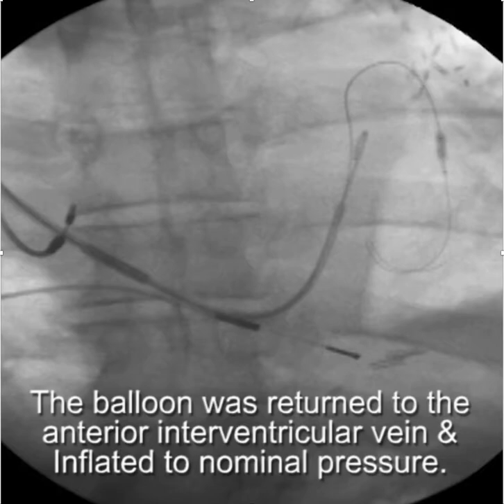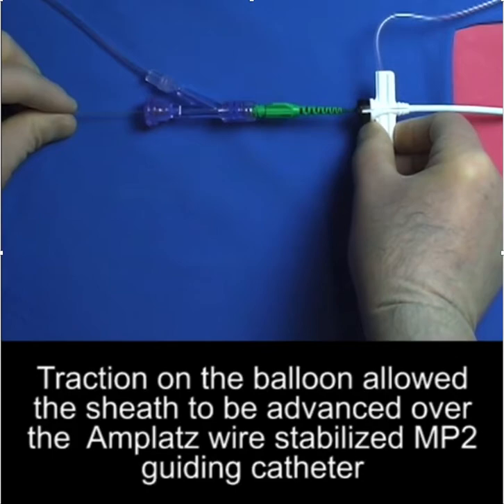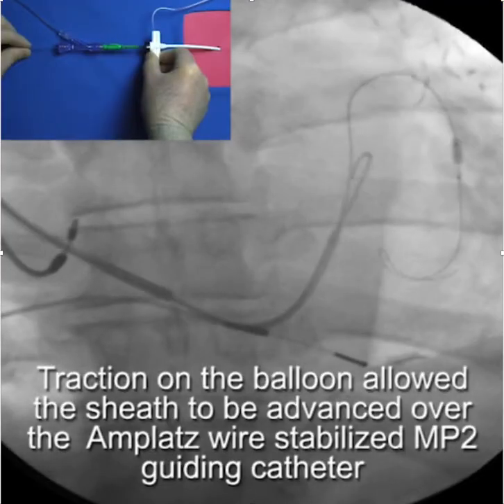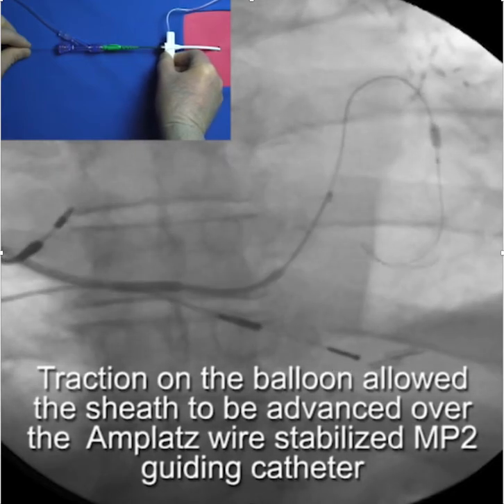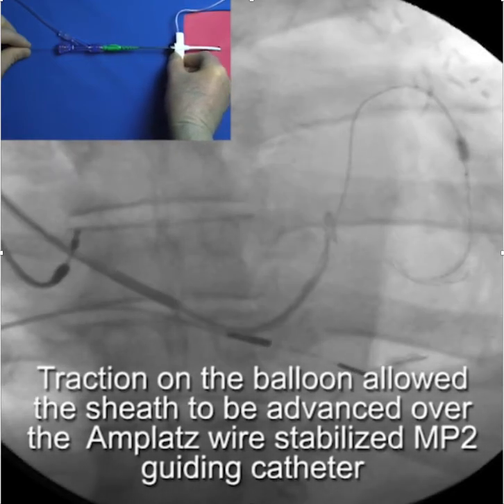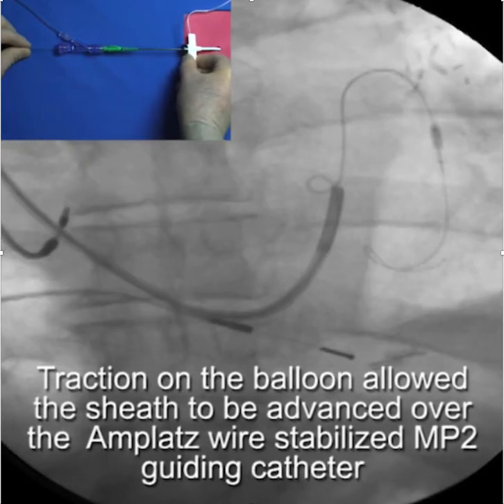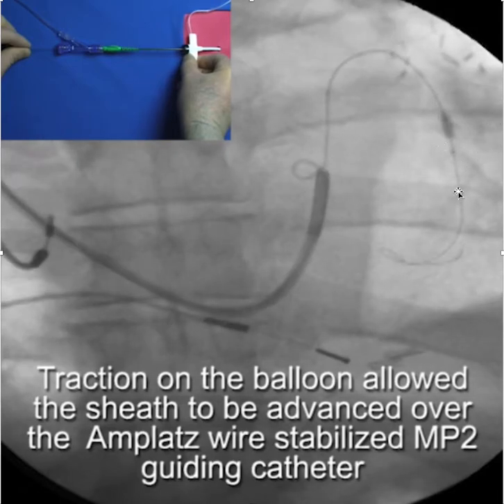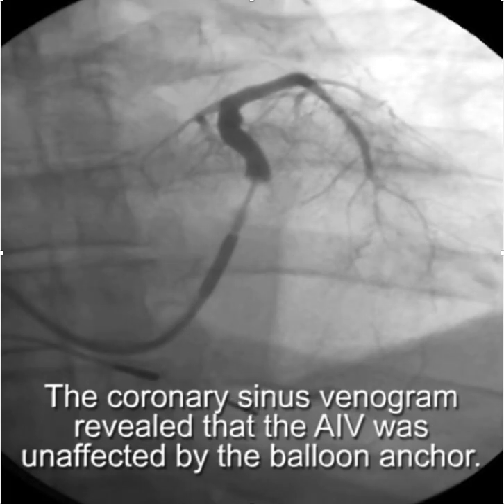So I had to put the balloon back out, inflate it, and once again apply tension on the balloon. This time I worked the sheath over the multi-purpose guide, stabilized by the balloon and the Amplatz wire. You'll notice there is actually a waist in the balloon, which when you're trying to create an anchor is an encouraging finding.